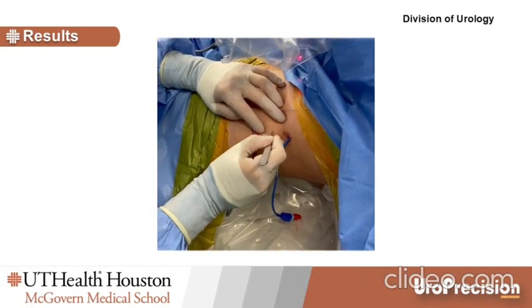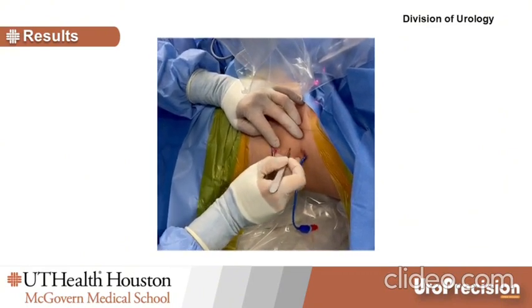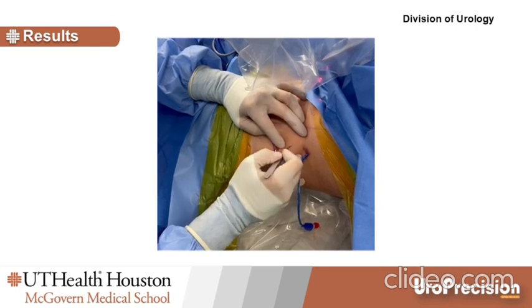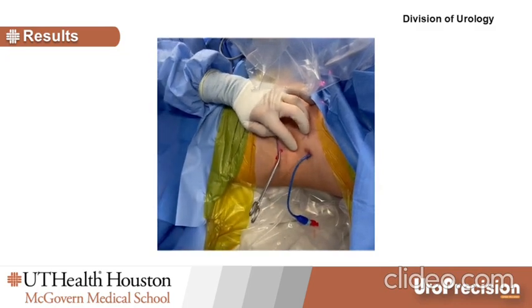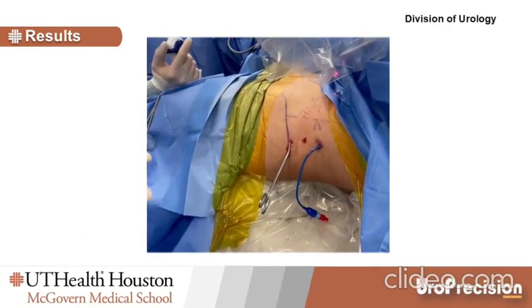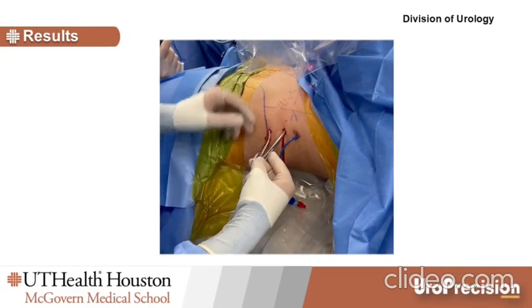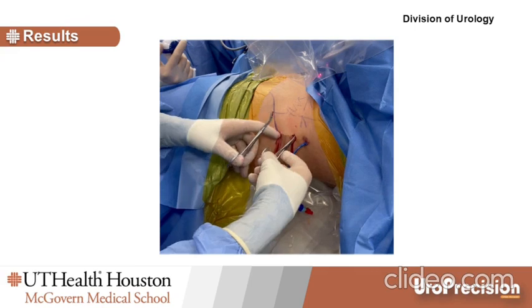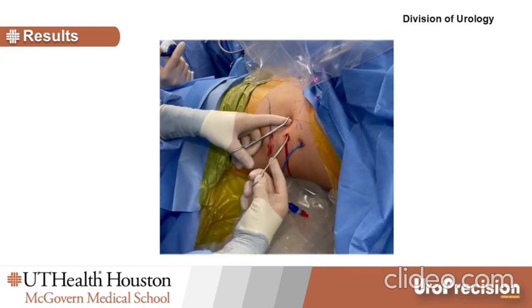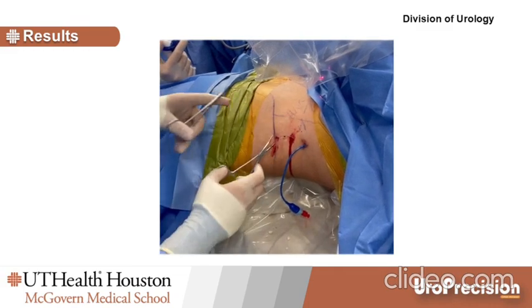subcutaneously. For example, if the wire emerges too close to the iliac crest, dilating at that angle can be challenging. In this situation, palpating the wire within the subcutaneous layer allows for a small, more cranial incision. By creating a path in this plane, the wire can then be redirected through the higher incision. This adjustment is sometimes necessary for obese patients, establishing a tract that is perpendicular to the calyx rather than tangential.